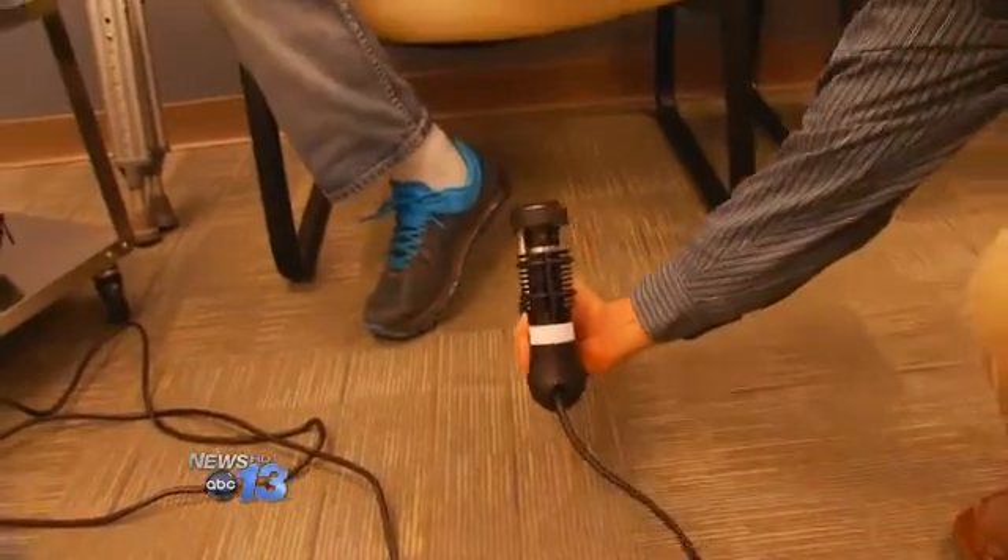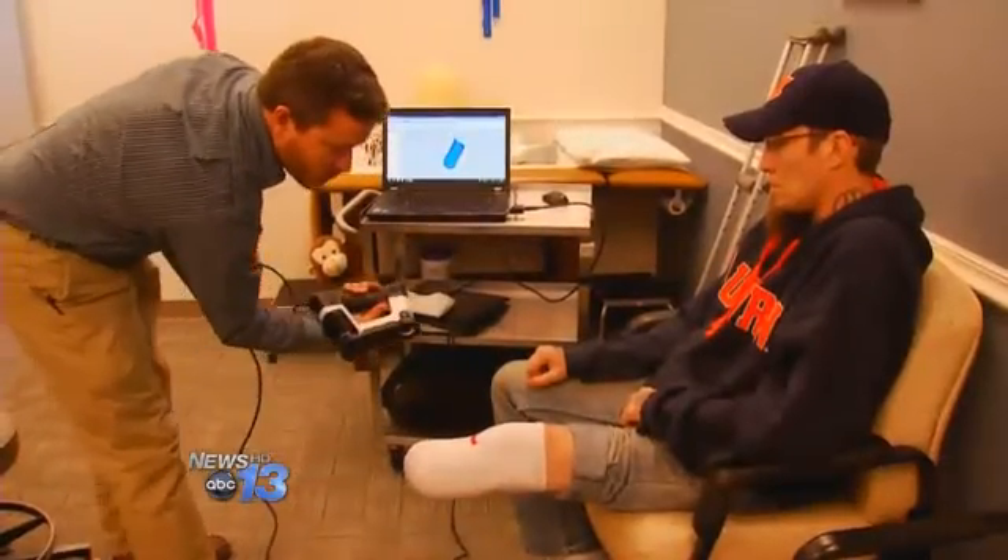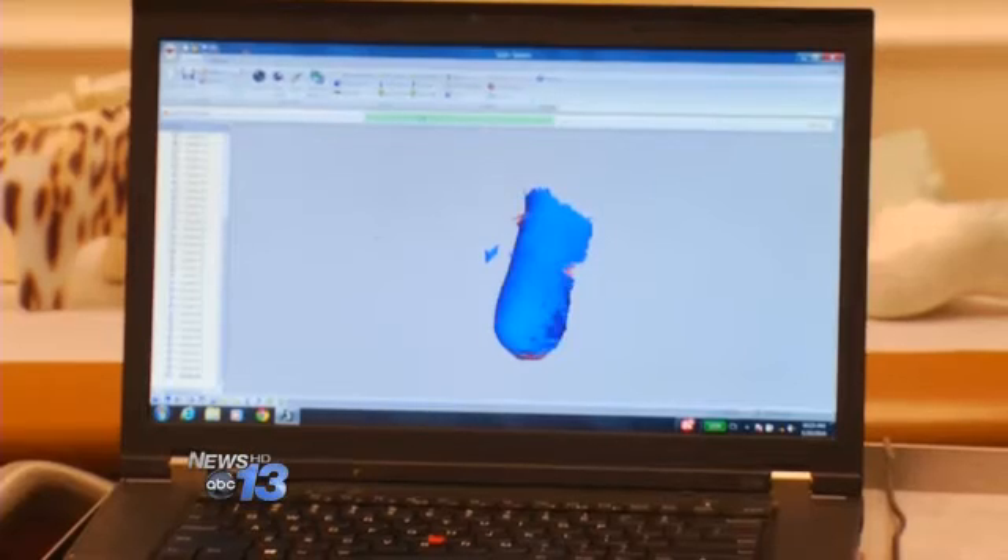Each individual flash is a three-dimensional picture. All the measurements are done without making a traditional plaster mold — that's what we had assumed we were going to have to do, and this is much quicker. This will be key in both the making of the liners and the custom portion of the prosthesis.